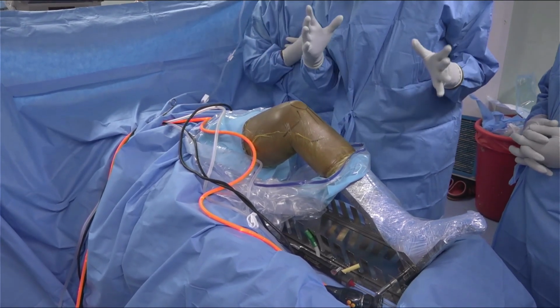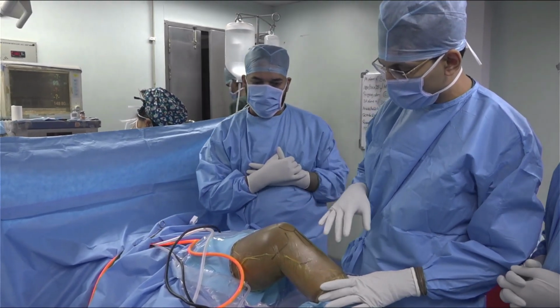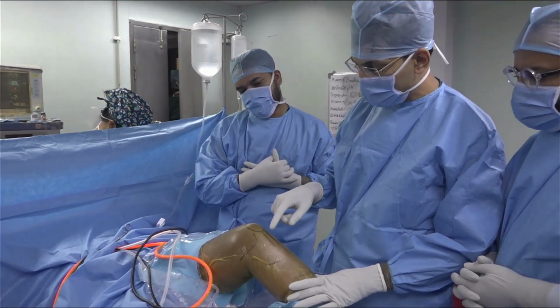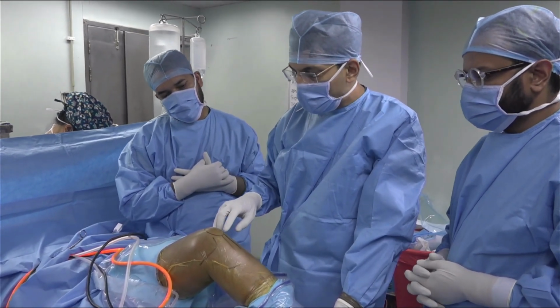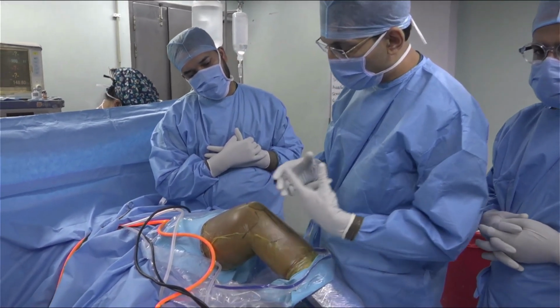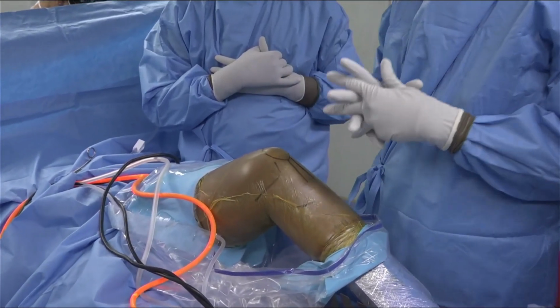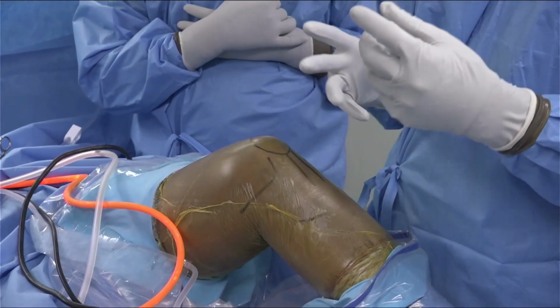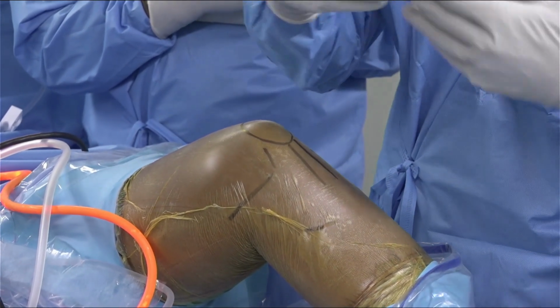Now as far as the portal is concerned, we have marked the portals. This is the patella, this is the patellar tendon. We have to make a lateral portal which is a little bit higher as compared to the standard lateral portal, and then you have an option of making two portals on the medial side. But what we have seen over time is the two portals are very close, and there is a problem of wound necrosis in between the two portals.